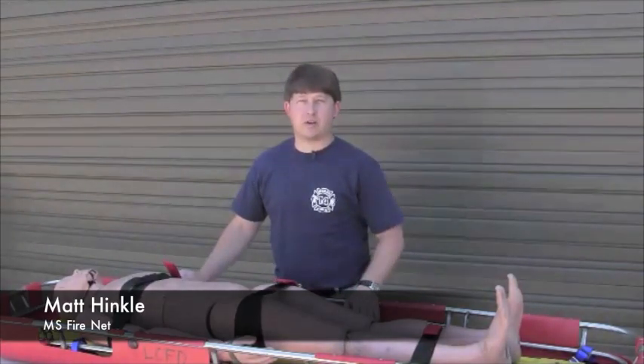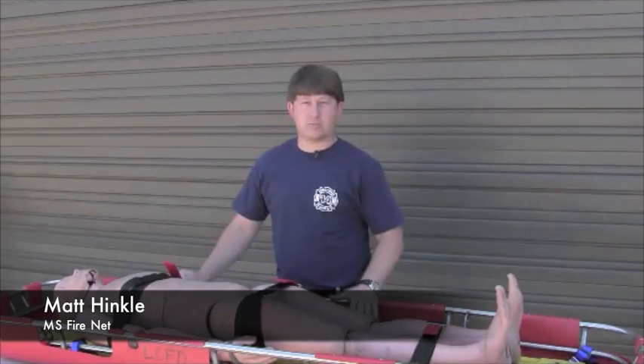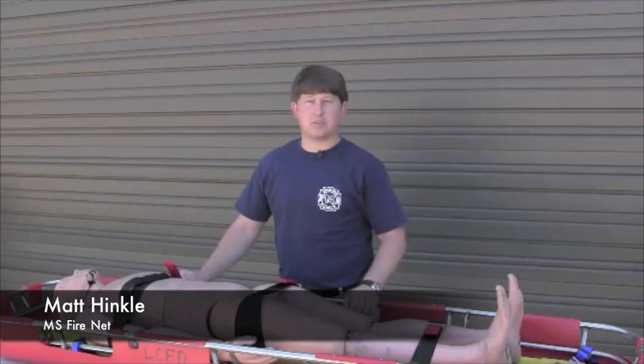Hi, my name is Matt Hinkle with MS FireNet. Today we're going to be going over some patient packaging techniques on a few of the different devices we carry. We're also going to talk about a few considerations we have depending on the scenarios at which we found the patients.